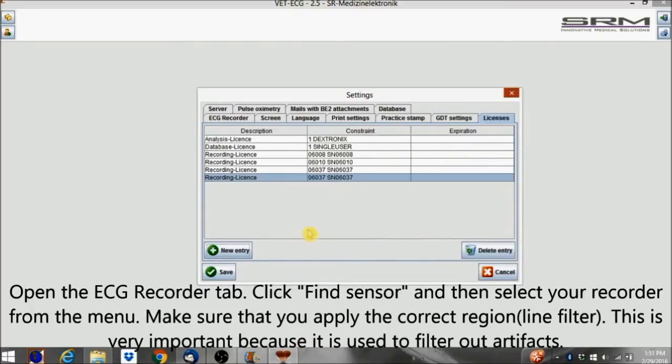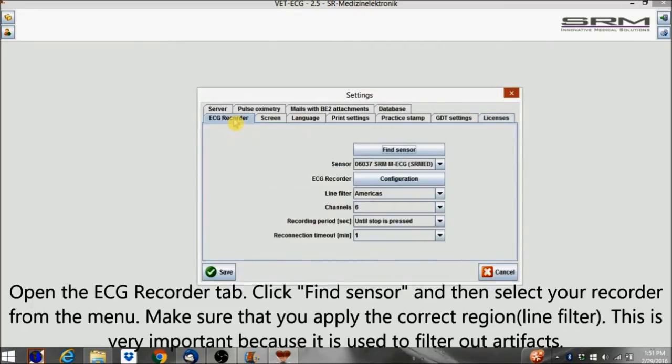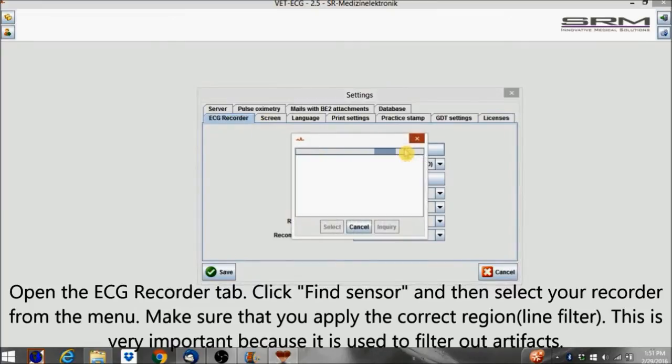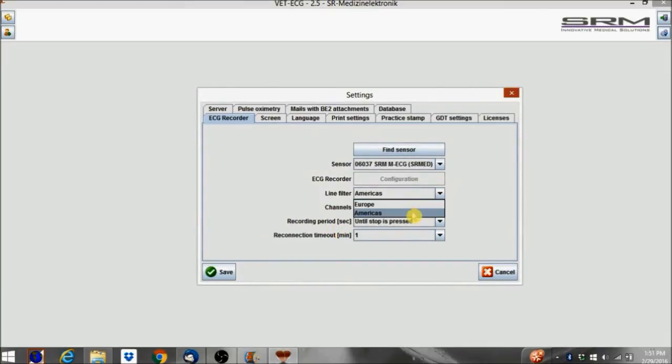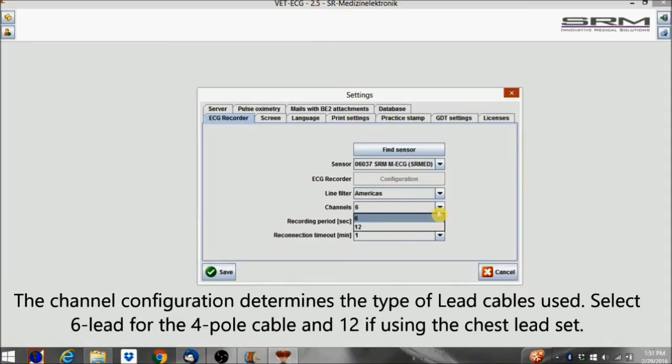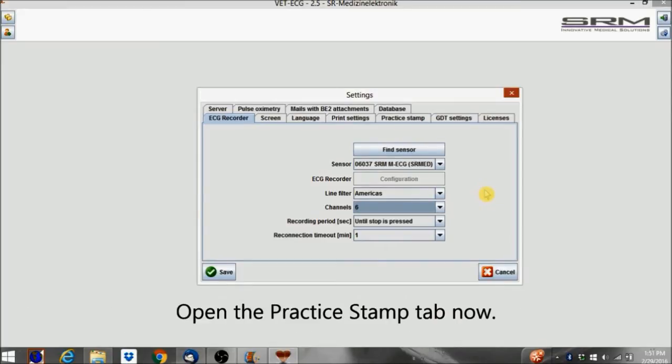Open the ECG Recorder tab, click Find Sensor, and then select a recorder from the menu. Make sure that you apply the correct region or line filter — this is very important because it is used to filter out artifacts. The channel configuration determines the type of lead cables used. Select 6-lead for the 4-pole cable and 12 if using the chest lead set. Open the Practice Stamp tab now.